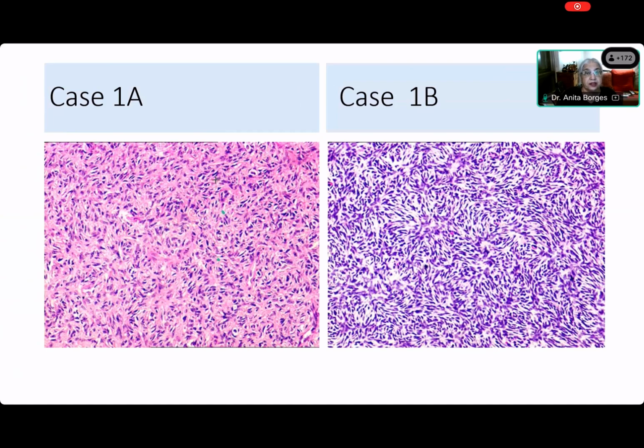Yeah, here is a point. There is a point. You can see the points from which, and what do I mean by the point? The center point from which everything is radiating out. Can you see that now? Maybe I ought to use something that's white. Then you will be able to see. This is the center point. Okay, this is the center point. Here is the center point. You see, all of these are radiating out.